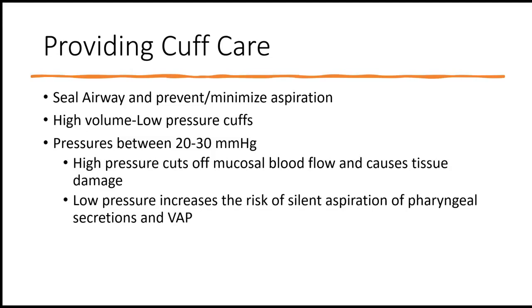So, providing cuff care. We've talked about this before, that those cuffs are used to seal the airway. They're necessary in mechanical ventilation, and they help to prevent or minimize aspirations in the lower airways.